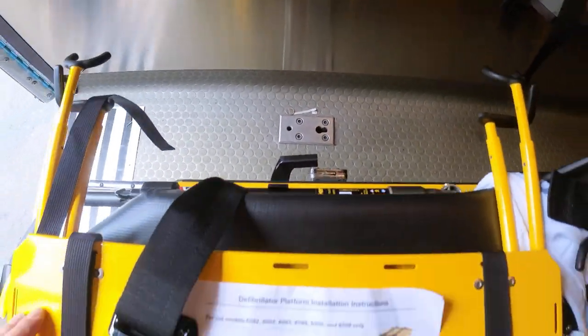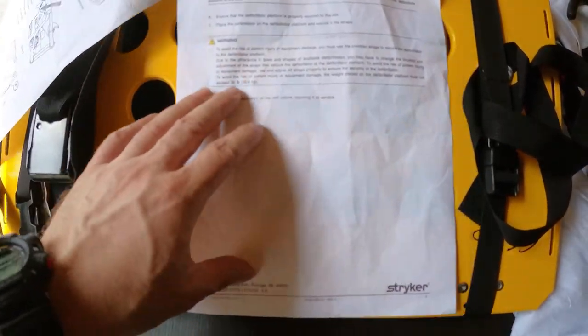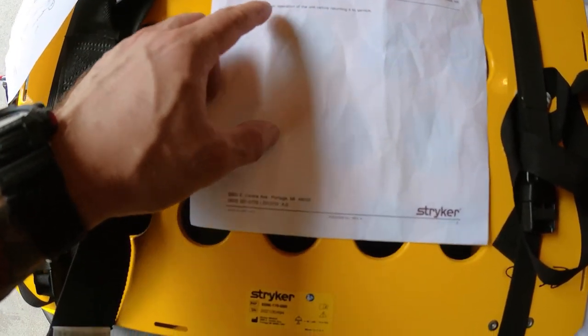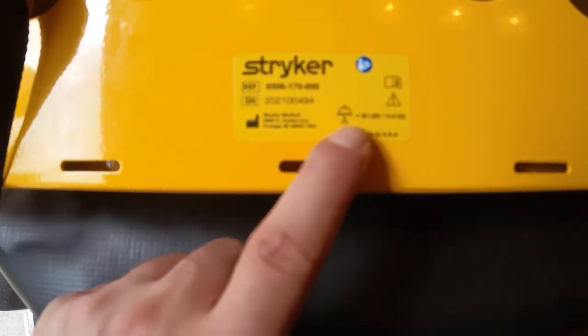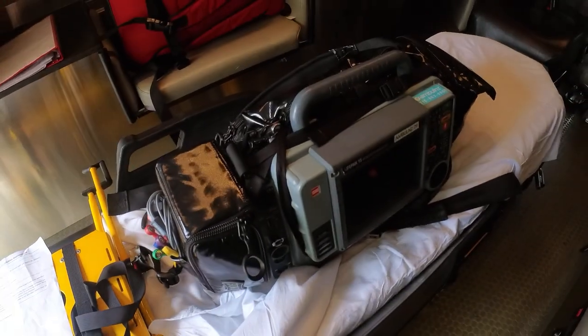One other important feature you definitely need to take into account: this device is rated for 30 pounds or 13.6 kilograms. If you ever lose these instructions, you can look at the actual device — you can see the Stryker label right here and it tells you 30 pounds and 13.6 kilograms. That's the max loadout on this device.